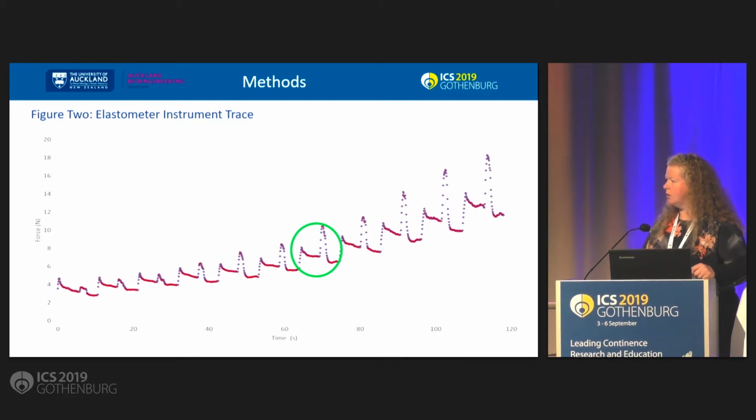If you stretch it and you hold it for a second, and then you relax it... No, the device is not relaxing. We're allowing the person to relax around the device. Right. Thank you. And there was no pain with any of our participants.